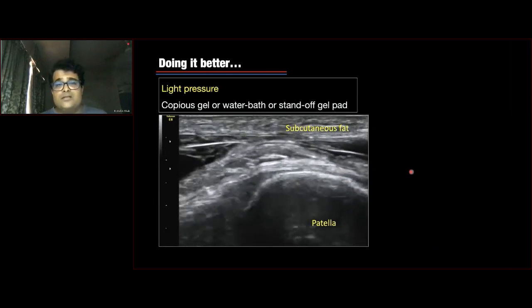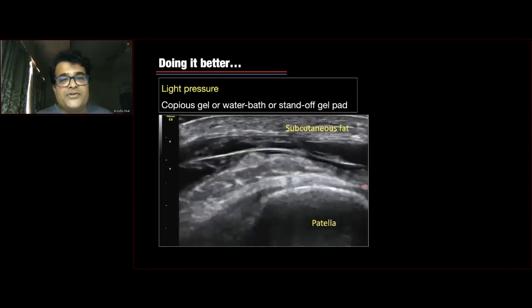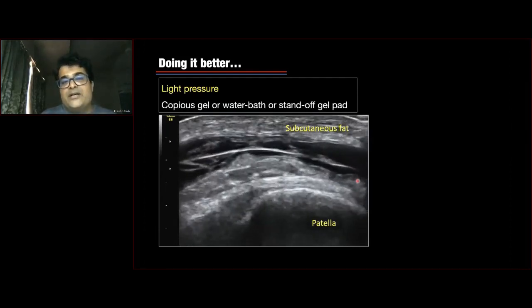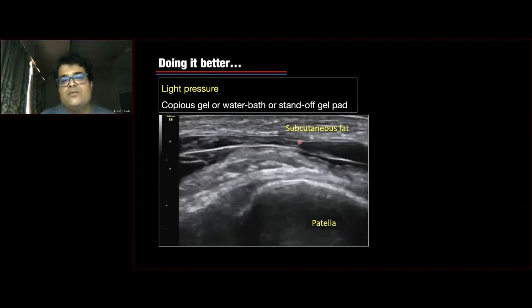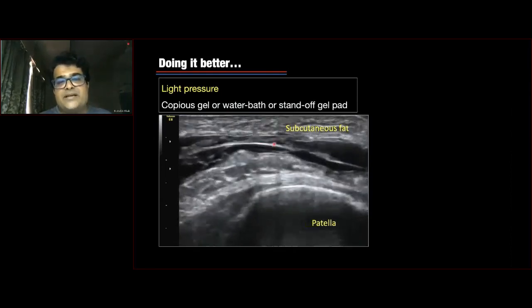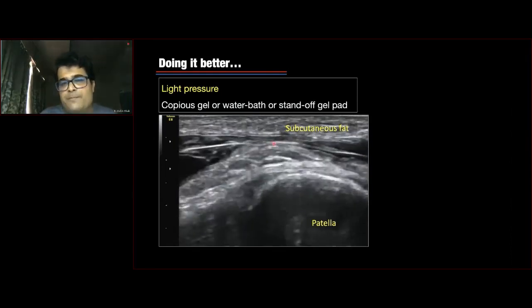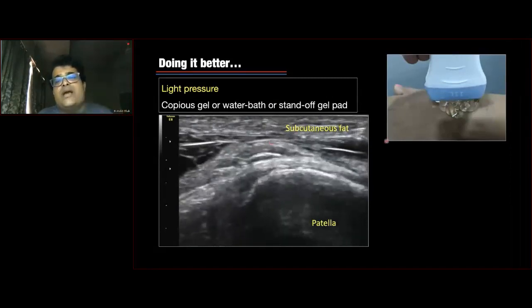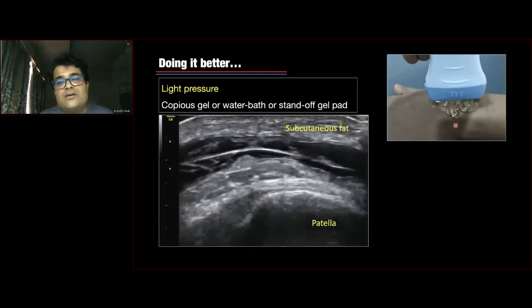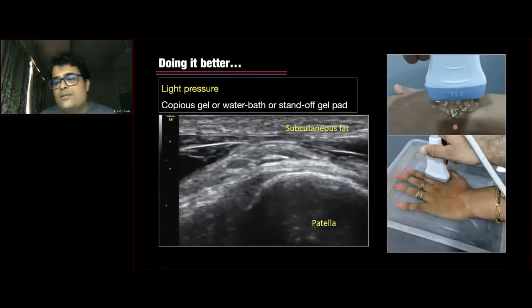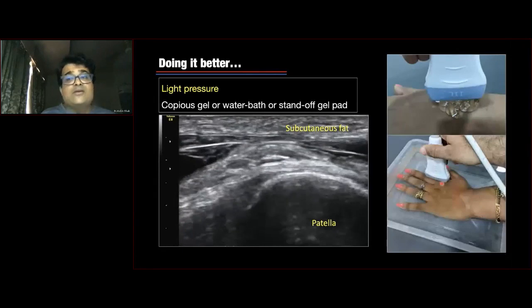Focusing on technique: give light pressure when evaluating superficial structures — too much pressure causes fluid to dissipate away and you'll miss effusions, as shown in this anterior knee image. Use copious amounts of gel or a water bath to create distance between probe and skin. If you don't have a high-resolution linear probe like the ML6-15 or a hockey stick, use a large amount of gel or simply place the hand or foot inside a water bath and put the probe directly on it. Trust me, it works absolutely fine and gives fantastic images.